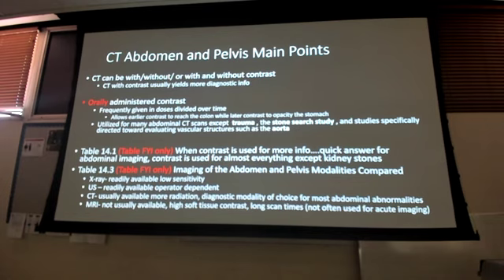But when you're out in your outpatient facilities and you're seeing patients in your regular outpatient clinic, and you feel the need to order a CT abdomen for any of their conditions, order it with oral and IV. Because they're going to go schedule their CT, and their CT is going to be next Tuesday at 1400. They're going to be given their oral contrast, and they're going to take it home. And they can start drinking it at 9 or 10 or whatever their instructions are. So by the time they come in, it's where it needs to be. They get their IV, they get their scan, they're in and out in 5 minutes. So outpatient, you want to order it that way. If you're in the ER, you're probably just going to do the IV and push them that way.